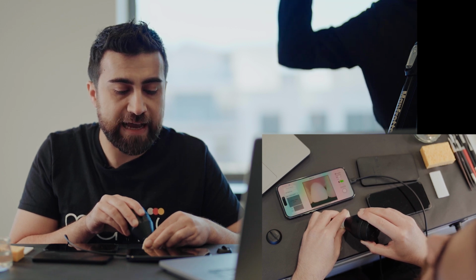Always make sure that when you take the picture with Optishade, the neighbor teeth are in contact with Optishade, so you should be fully touching the neighbor teeth. Then position the tooth in the middle of the screen. Block the light with your hand, because we don't want external light entering the image. Once you find the right position, keep Optishade steady and click on the button, either on the device or in the app. Okay, so the picture is taken now.